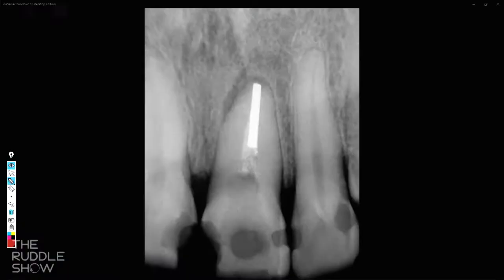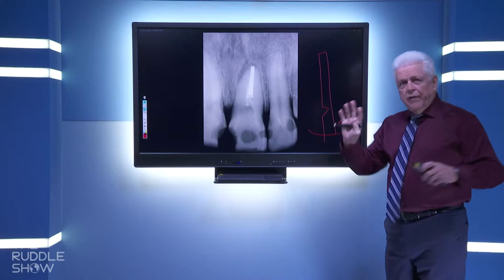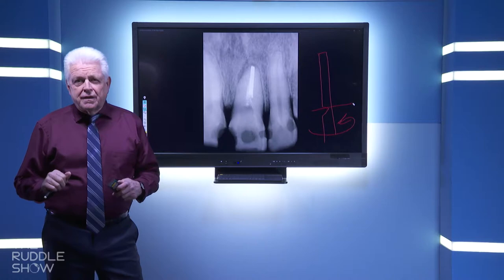A lot of times, if a dentist was going to do a post, as an example, they would take a silver point, notch it, place the silver point in a linear motion to length, then rotate the top, and they would break it off right there. And that way a post could go in if deemed necessary. So we had thin ones, post-sized ones, and then we have basically the sectional point or the split cone.